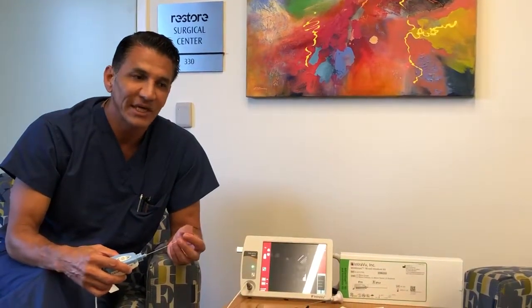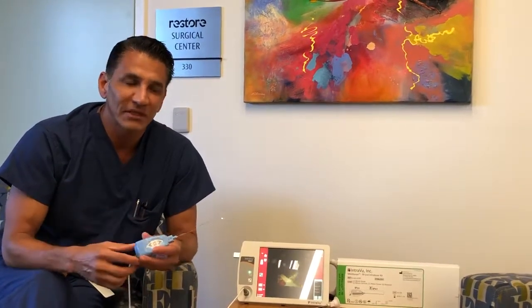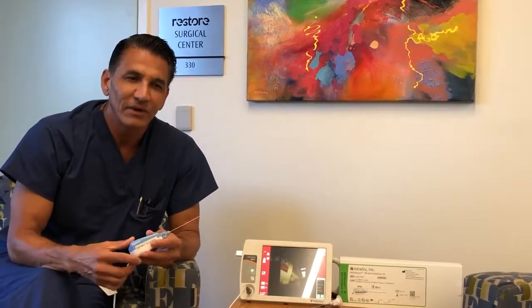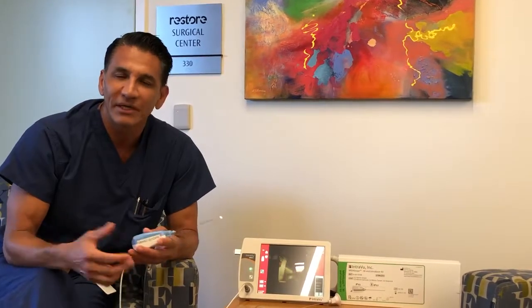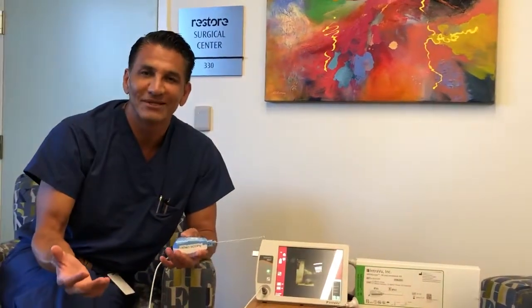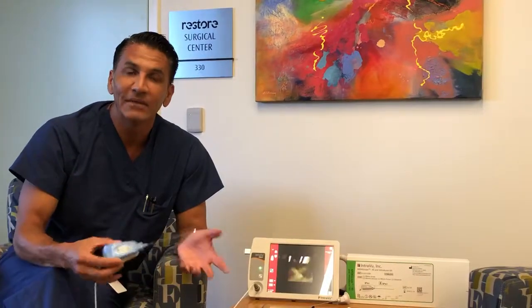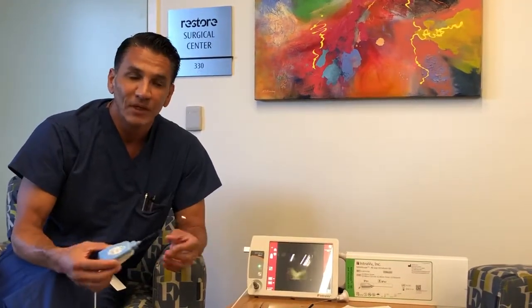And let's just say they don't have gross symptoms of locking. It's a hard question to answer, and it's one of those questions that sometimes we have a hard time answering with having comfort in our heart, saying, no, you're not going to damage it. Because do we really know they're not going to damage it? It's hard to know. So the option can be, let me put the needle scope in you. It takes 15 minutes. We can do it later today, tomorrow, whenever, and let me look at it. You don't need general anesthesia.